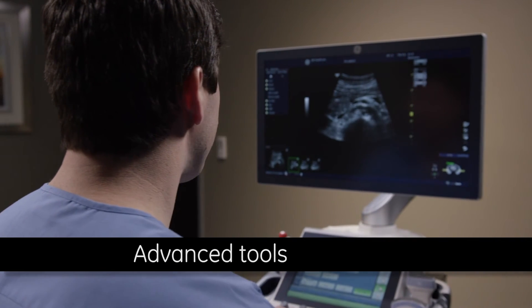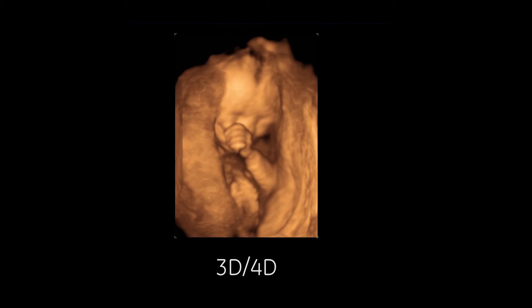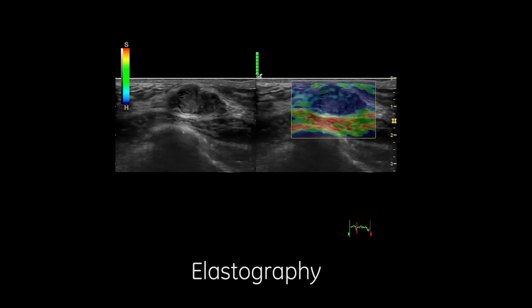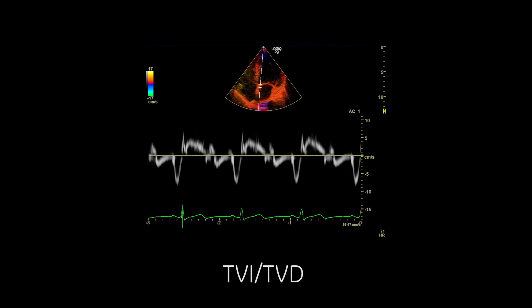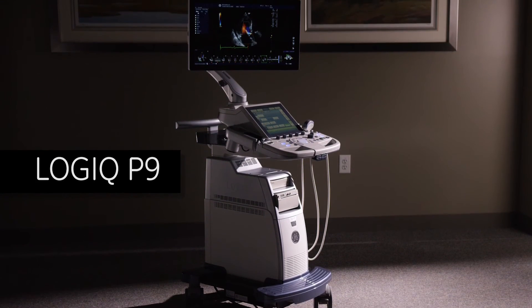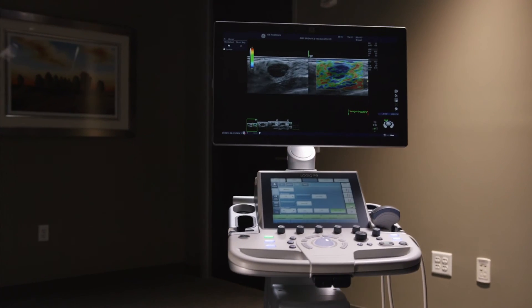Advanced imaging tools are available when needed, including B-Flow for blood flow visualization, 3D-4D, elastography for tissue stiffness evaluation, and cardiac tools such as TVI-TVD. Easy to learn and use, the Logic P9 supports high efficiency for busy schedules and provides great value.